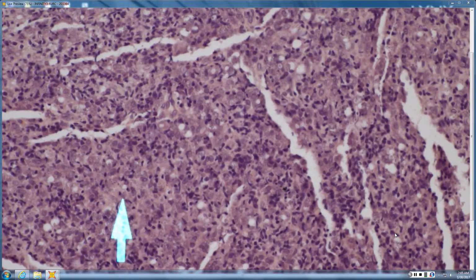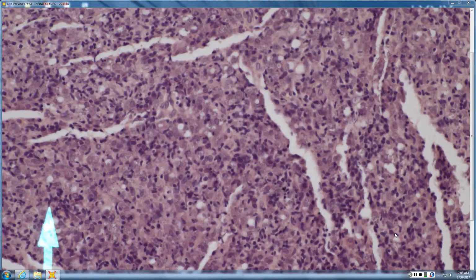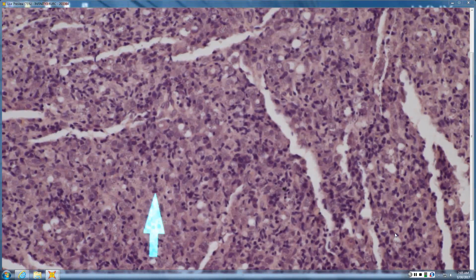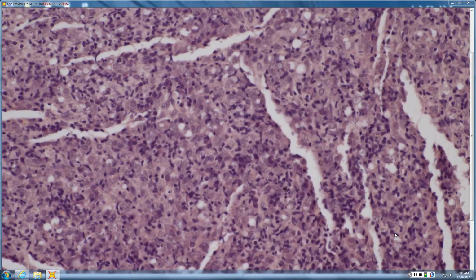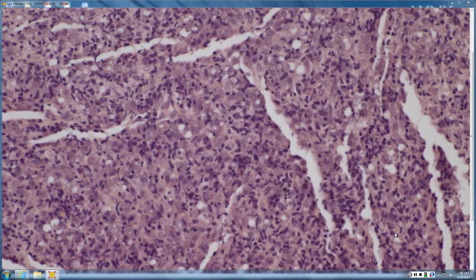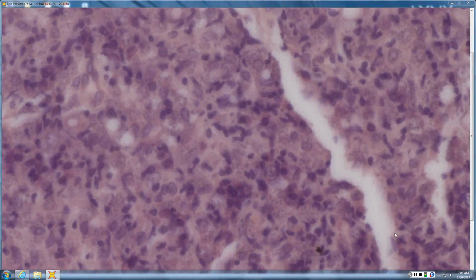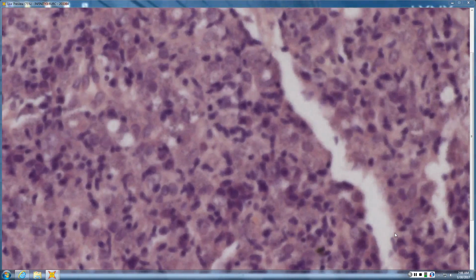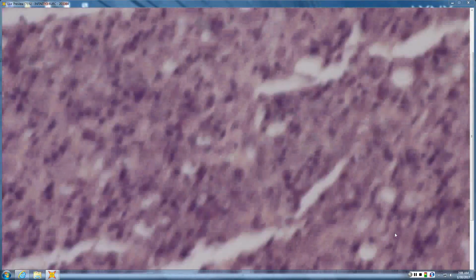And again, they almost come out better on the TV screen, but all these little organisms, and it brings up a differential. So it's the parasitized histiocytes differential, and there's some plasma cells in here, some lymphocytes, of course, tons of histiocytes. And you may have to do some stains to differentiate it from histoplasmosis. You can look for the marquee sign, which is helpful, but it's not necessarily pathognomonic.